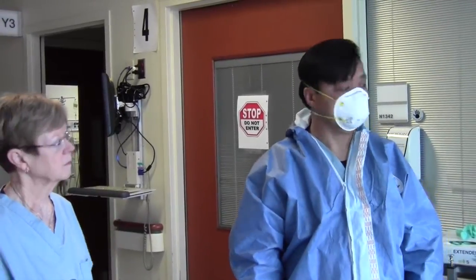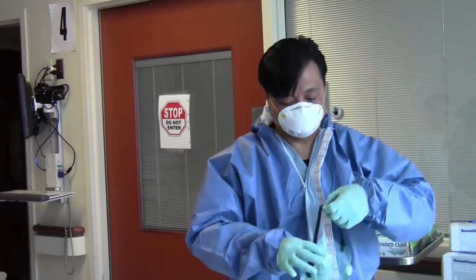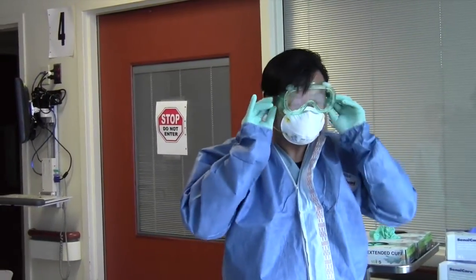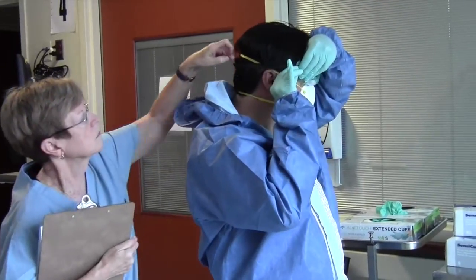Step 6. Put on goggles. These are anti-fogging goggles. Adjust the goggles so they're snug to your face. Remember that all facial PPE adjustments must be done in the donning area and you need to refrain from making adjustments in the patient's room.